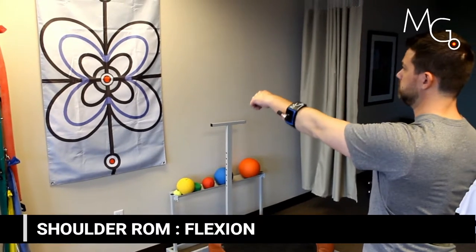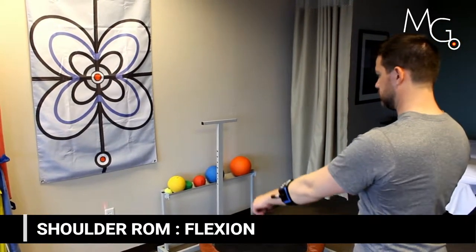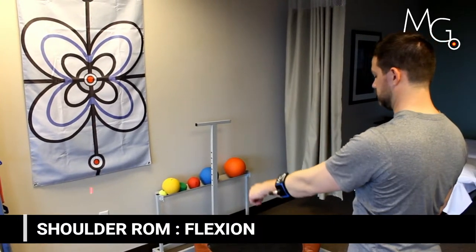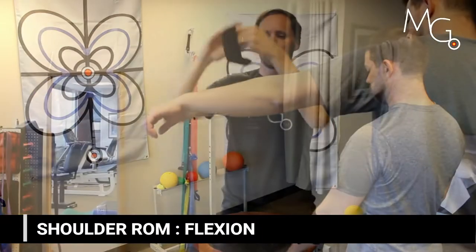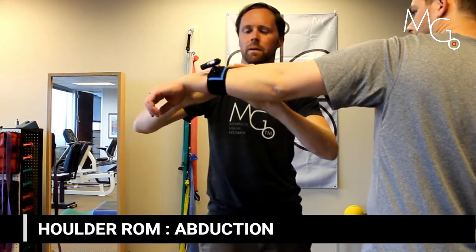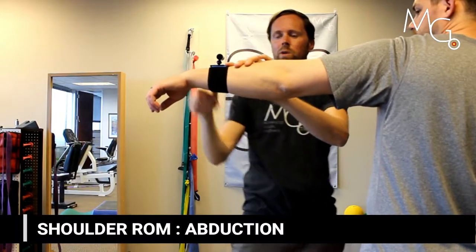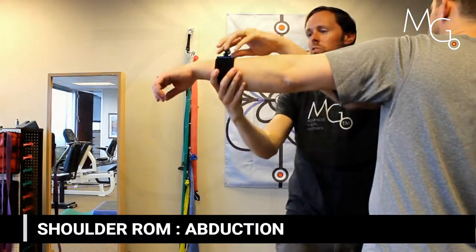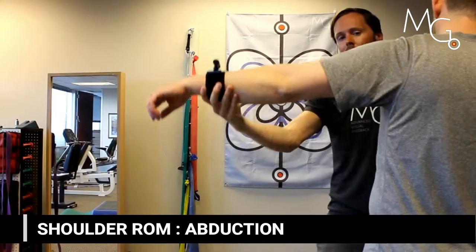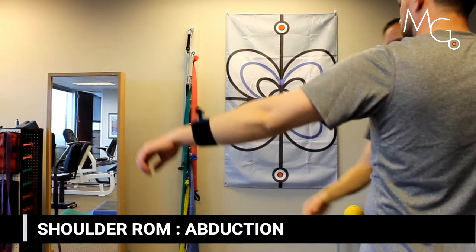You can easily adjust the angle of the laser pointer to cue them to move higher or lower to hit the same target — just angle the laser upwards or downwards. Once the patient is positioned, you can add a visual marker anywhere and encourage them to get back to where you brought them, or bring the laser pointer back to a specific target.